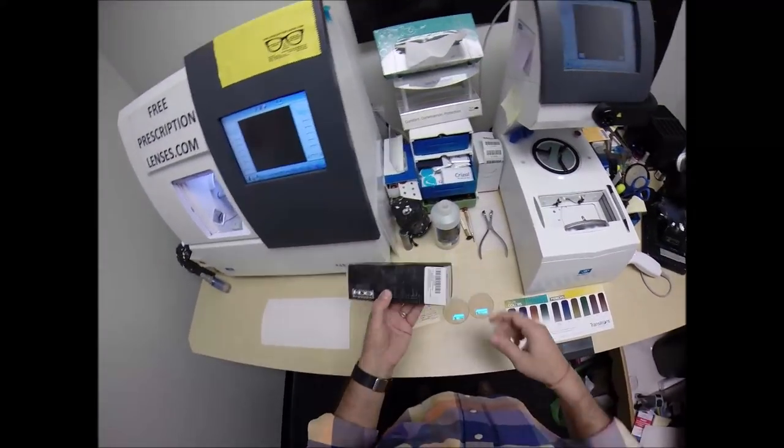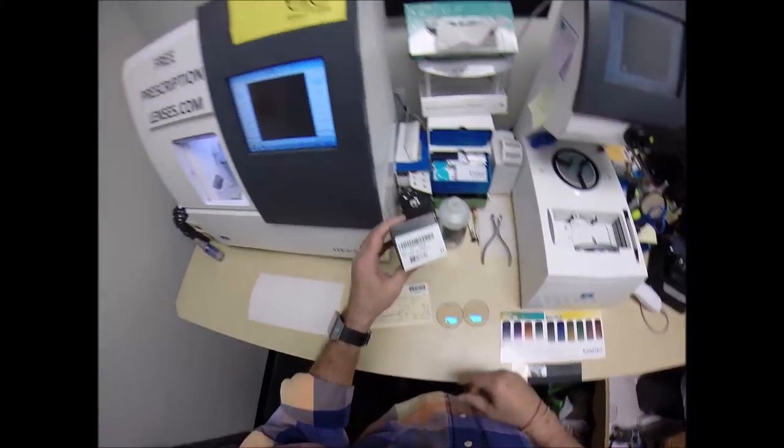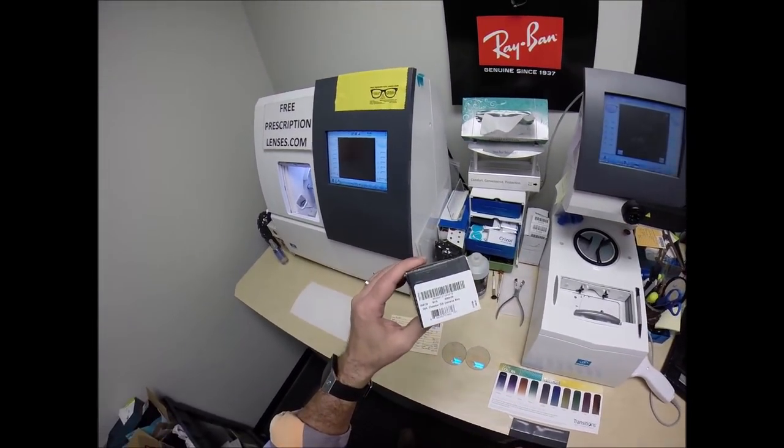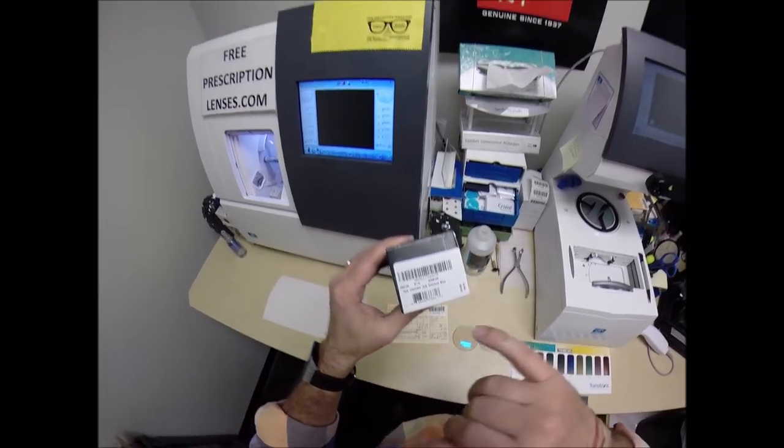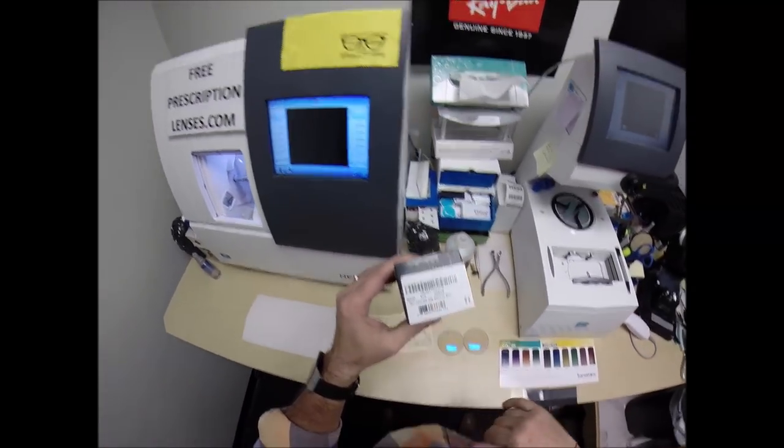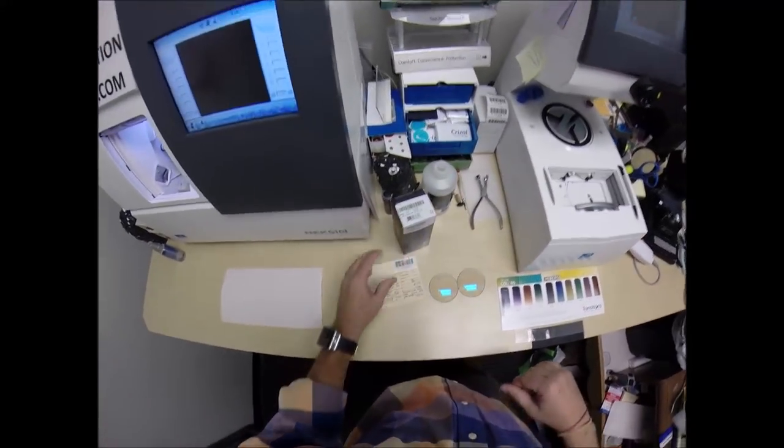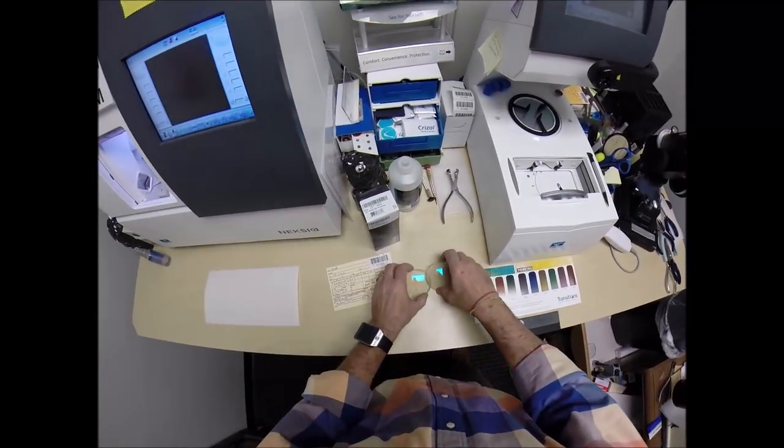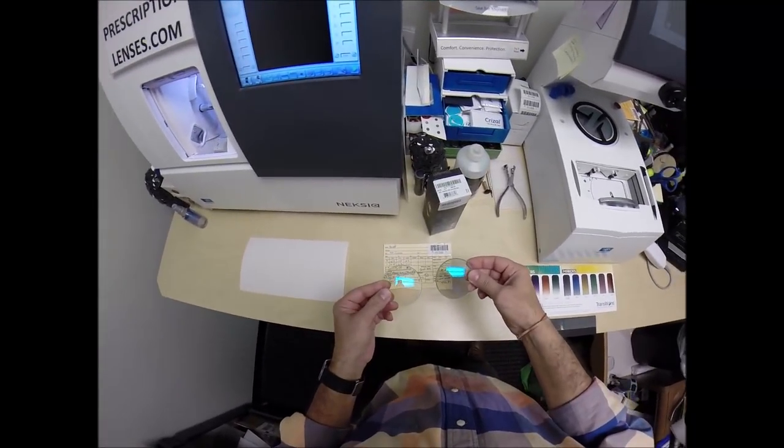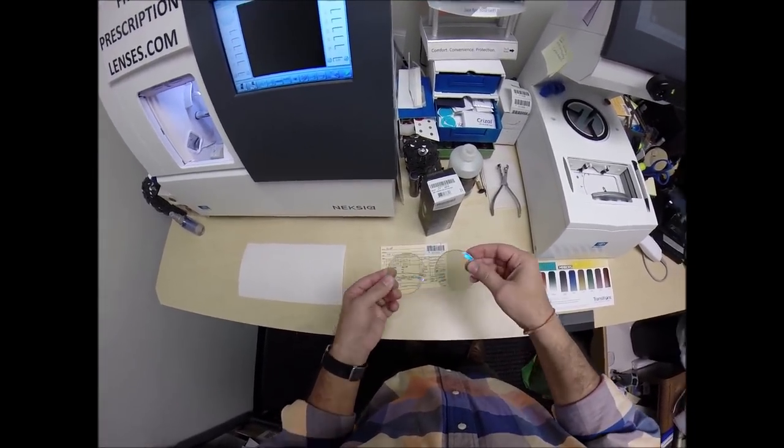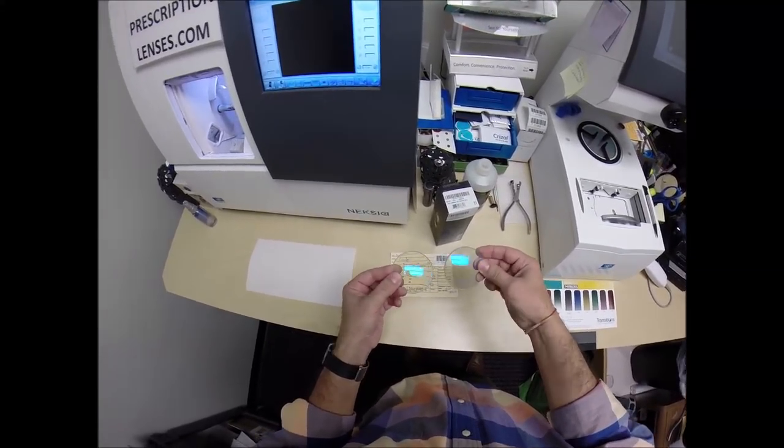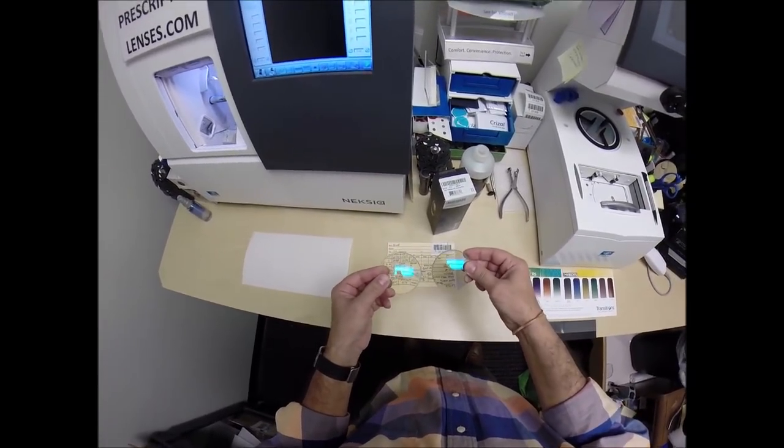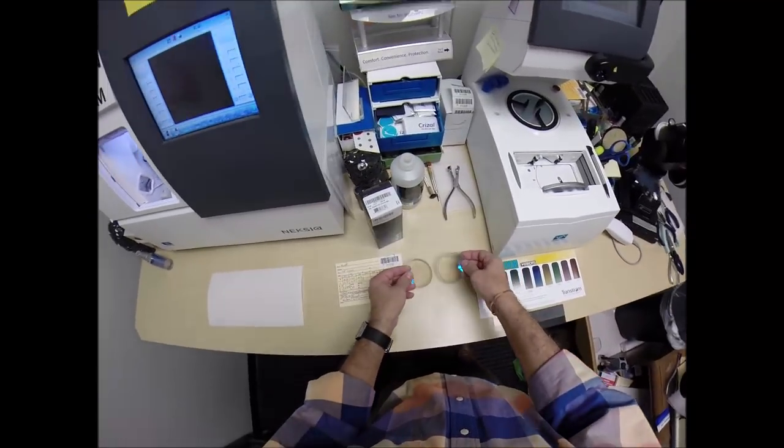I get to cut really cool lenses for a really cool frame. This is the Oakley Chamber, model number 8138 in 53 eye size, color 05 Universe Blue. I'm cutting Transitions Extra Active Gray Lenses in the Invisible Bifocal with the blue flash mirror.